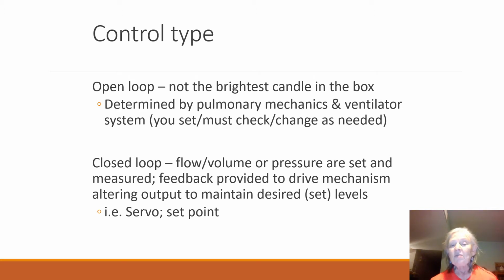Some of the names for these are servo. If you guys remember the servo wire from Therapeutics 2, where we talked about the feedback with the ventilator heaters, your Conchotherm, and things like that. This is the same principle. Set point's another one. So there's all different names that tell us that the ventilator can do this for us.